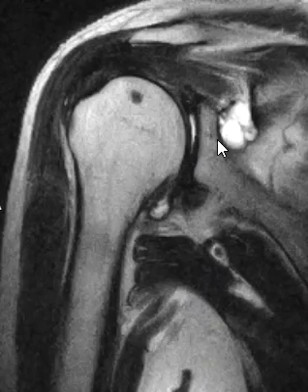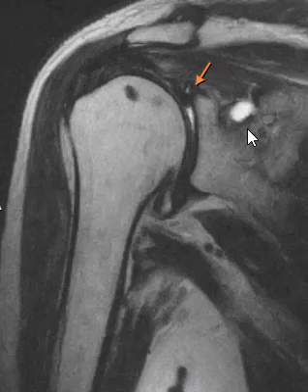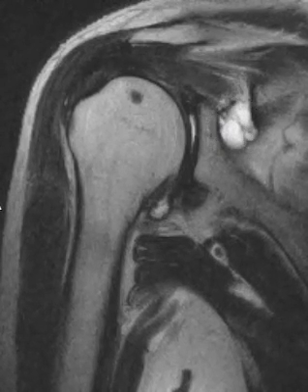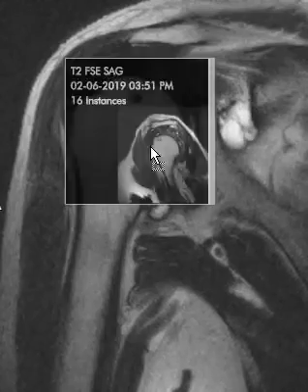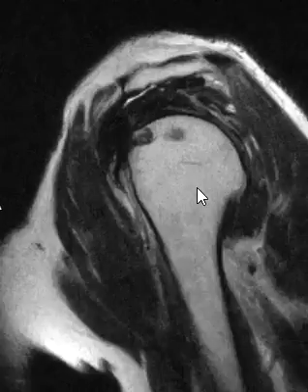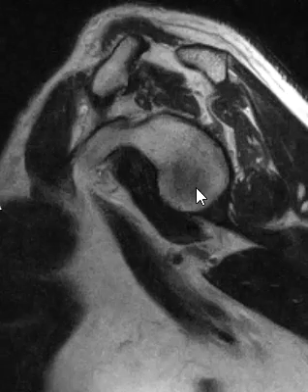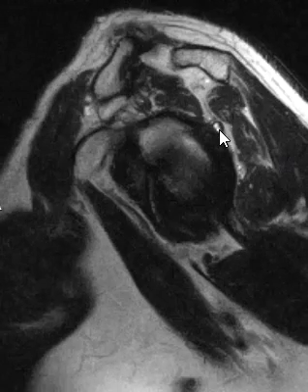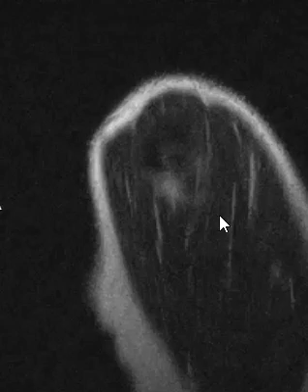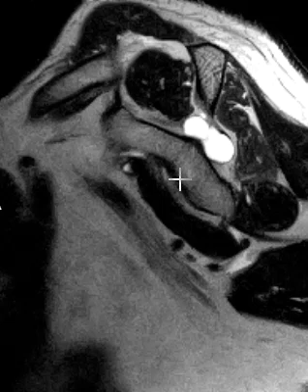There's an associated septated paralabal cyst over here. The paralabal cyst goes into the spinoglenoid notch and it looks like it compresses the nerves. If we put up a sagittal T2 view, we can see that's the front. Going medially, we can see a little component of that paralabal cyst going medially, and right here is that cyst in the spinoglenoid notch.